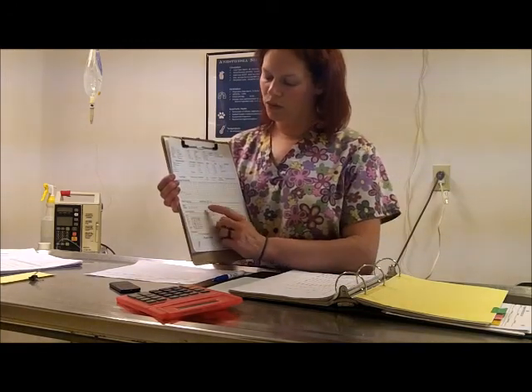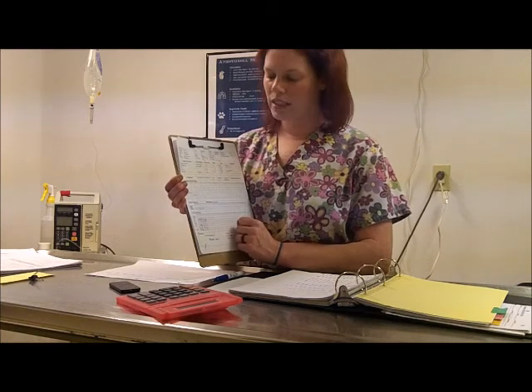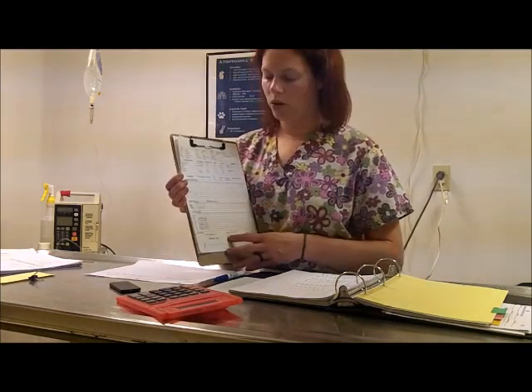The next section is our fluid administration. We have the fluid type and the fluid rate at which we're going to be doing throughout the procedure. At 5-minute intervals, we can total up the amount of fluid that the patient receives. Any changes that need to be made in our fluid administration should be noted as well.